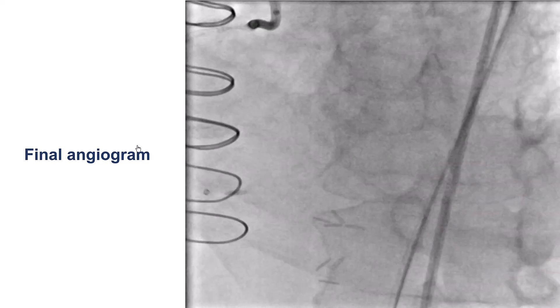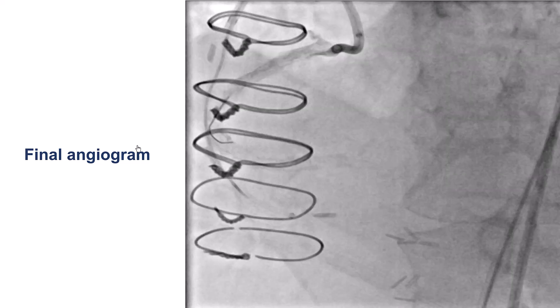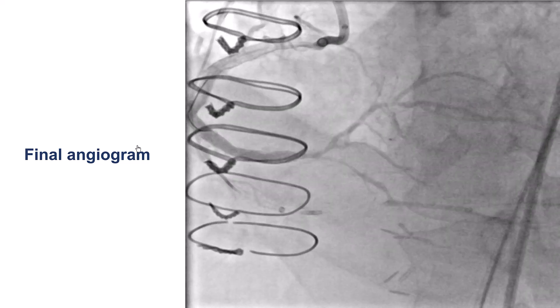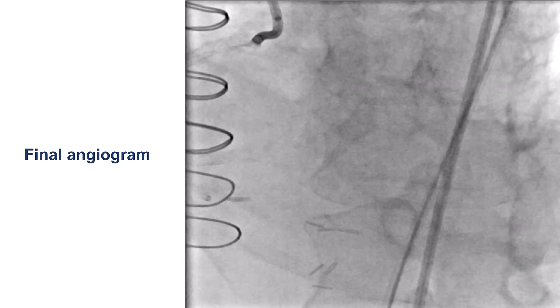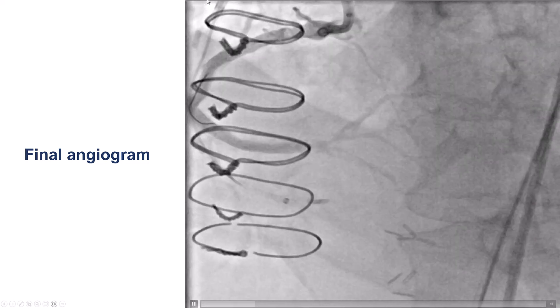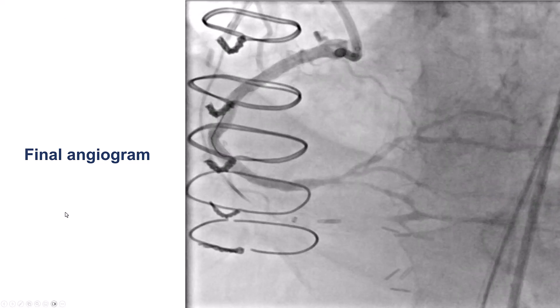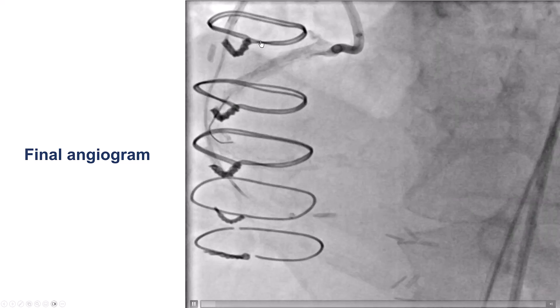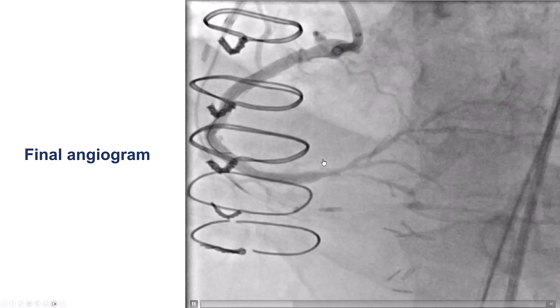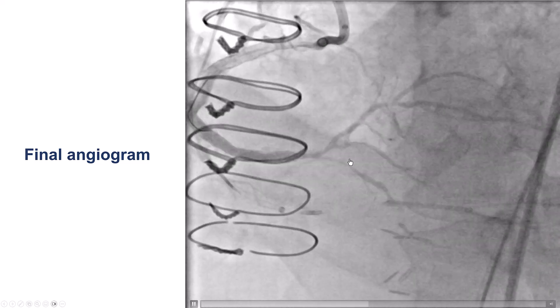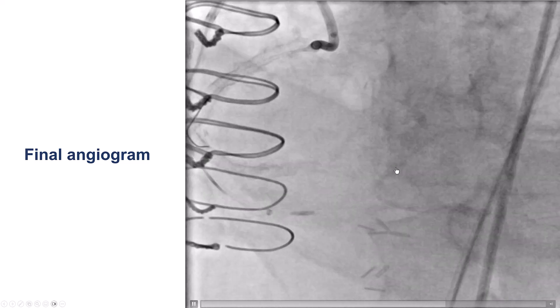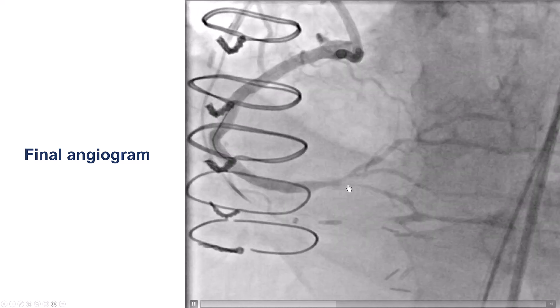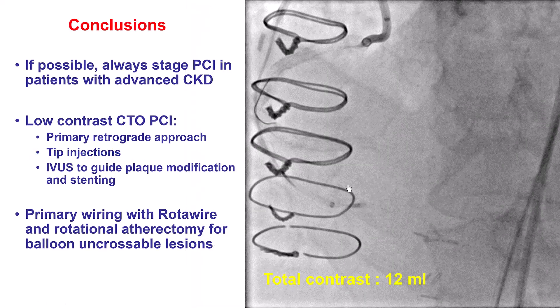We then did just one injection — this was the first full injection during the case — in which we see the final result. There is no perforation, and we have good flow in the right coronary artery. There is diffuse disease distally, but we decided not to treat this for the time being, and the patient did pretty well.